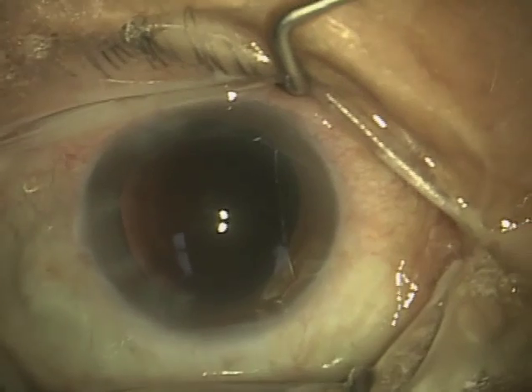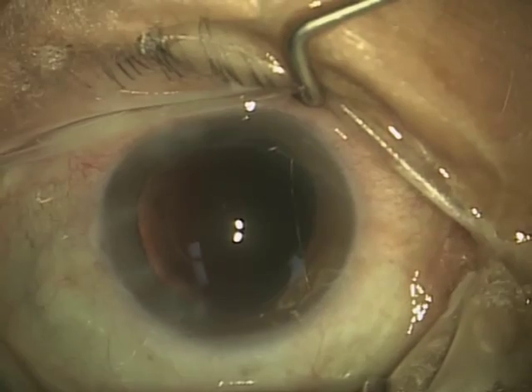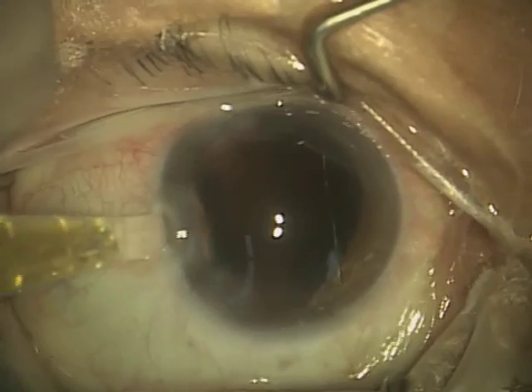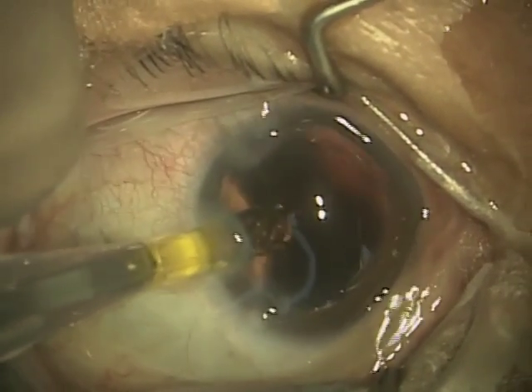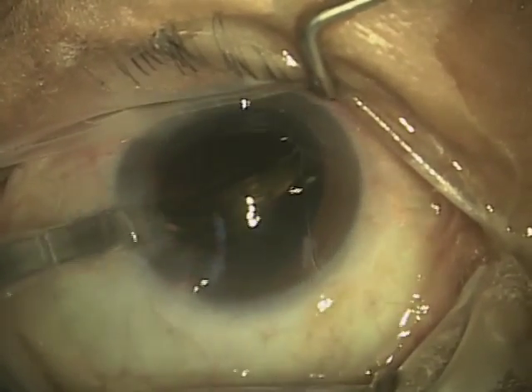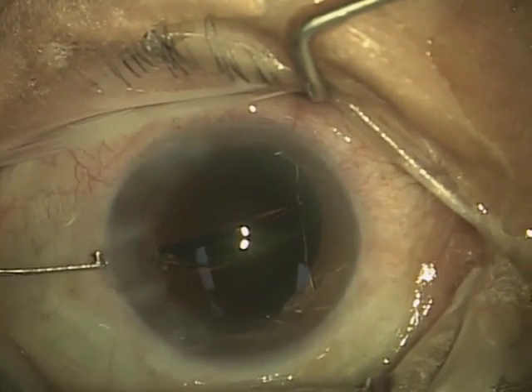In the last segment, I had just placed the viscoelastic into the anterior chamber, and now we are about ready to place the lens into the eye. This here is the lens insertion device, so I place this against the incision, and I actually use what's called wound assist, which uses the incision to assist my delivery of the lens into the eye.